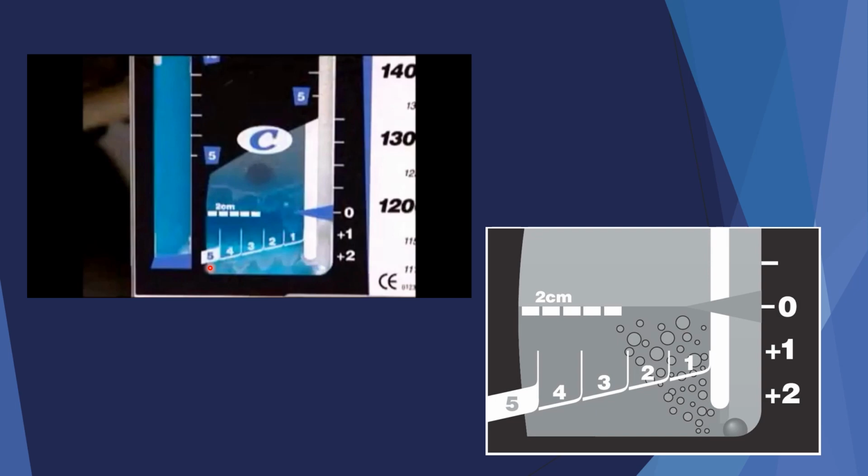What you're going to see is when you have a patient that comes back from chest tube placement, or just comes out of surgery that had a chest tube placed in surgery, it is going to be normal to see some air bubble up and out. It's going to come down and bubble up and out, and you'll see it looking like that. As the lung re-expands, we expect that to diminish.